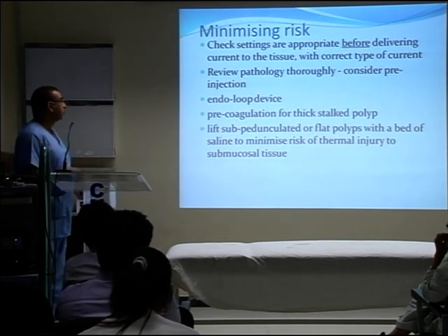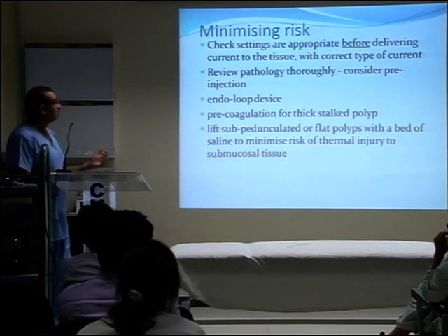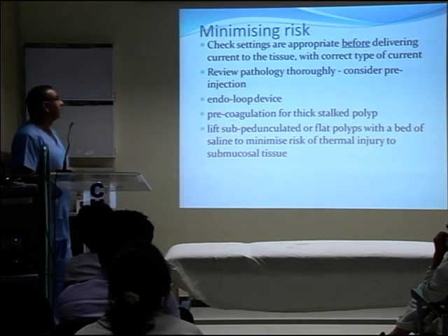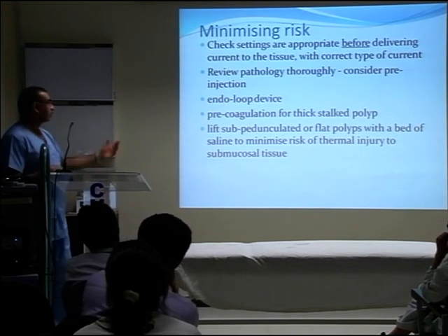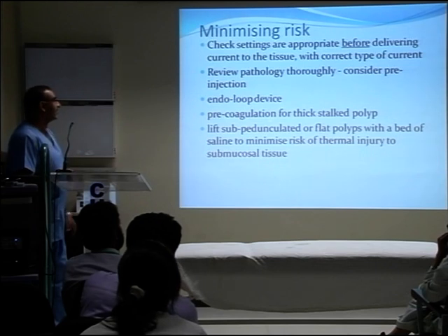You can use the endoloop device, but as I said, you should only use it if you are using it on a regular basis. In our department, we use it fairly infrequently, and if I get a new nurse, it is quite fiddly, she can't work it and makes a mess of it. And especially these are big polyps, so you don't know. So I tend not to use it now. I just use a polypectomy. If it bleeds, then I just catch the blood vessel. I found it very, very tricky, so I never use it.